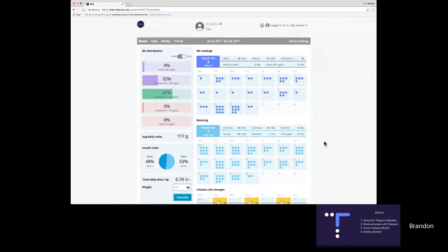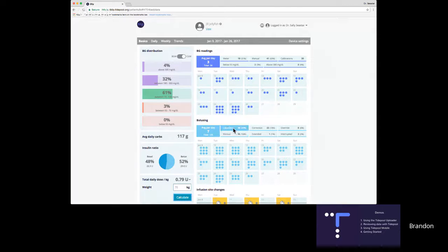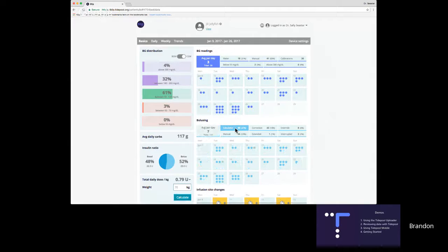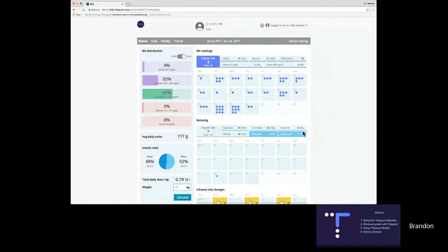Let's dive into one of these calendars — let's look at bolusing. Not only do we see how many boluses she's doing per day, but we can also filter on any of these bolus types. We can see when she's using her calculator boluses and when she's not, or that she's only used the extended bolus feature one time in the last three weeks.